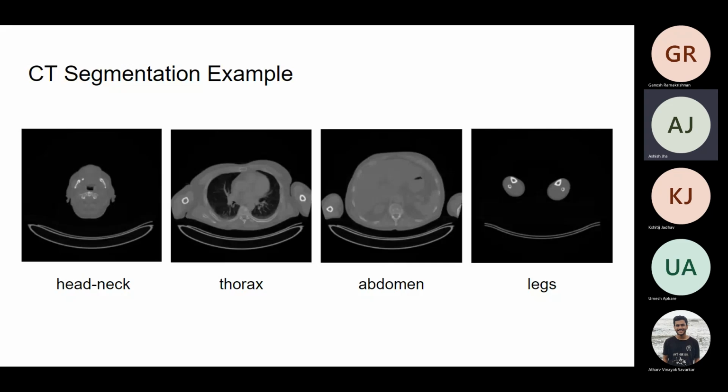So I believe how does it make a difference? Suppose some tumor is moving from the neck to the thorax. We'll be contouring that tumor in the thorax as well as in the neck. Just a moment. I just want to ask Atharva. Atharva, is our contouring restricted based on the segmentation that we do? No, it's just based on the intensity and shape of the tumor. So if you find something in the neck and it continues downwards into the thorax, you will be able to identify it, right? Yes. Okay, then why are we doing this segmentation?